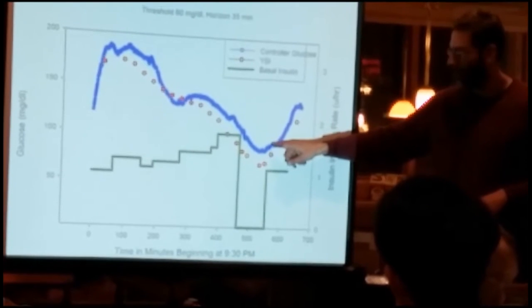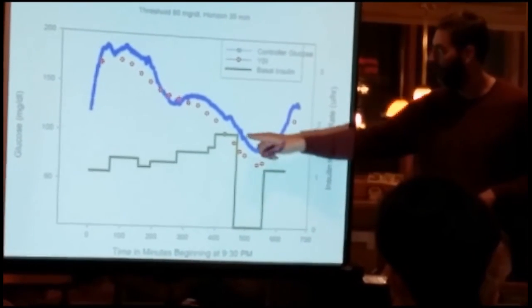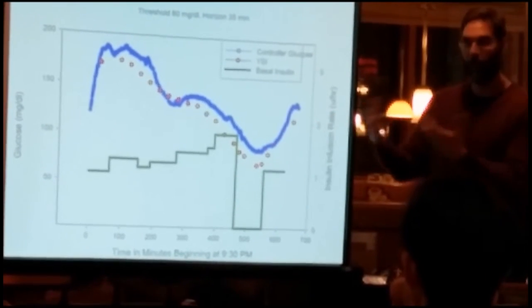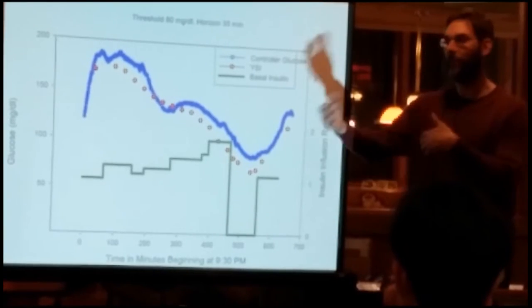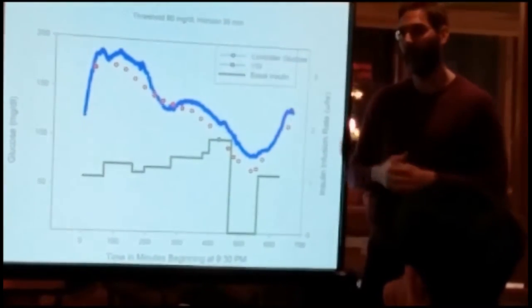And guess what? It works. Okay? And so instead of this person continuing to go down, it took a little bit of time, but this stopped from getting low. Okay? So that's the advance, turning it off before you get low when we're predicting you're going to go low.